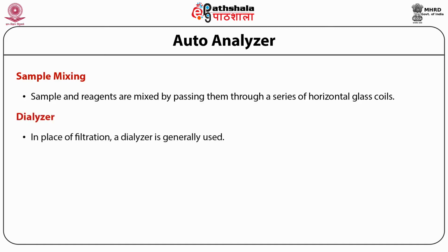In place of filtration, a dialyzer is generally used. This consists of two matching grooves cut in a pair of transparent plastic plates. The plates are clamped together with the grooves separated by a cellophane membrane.